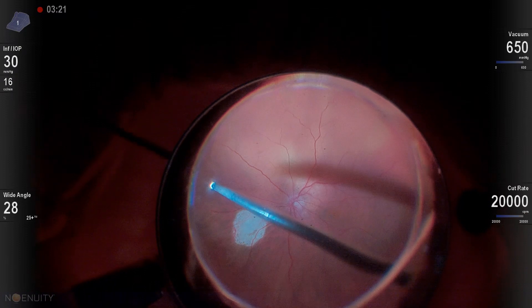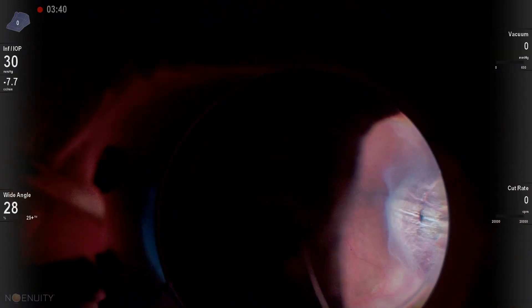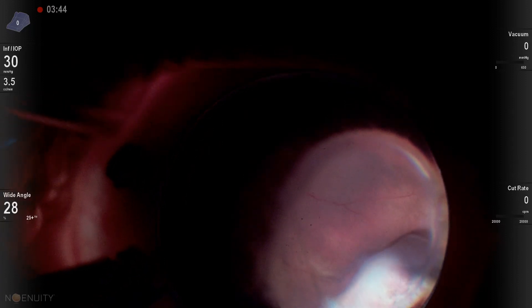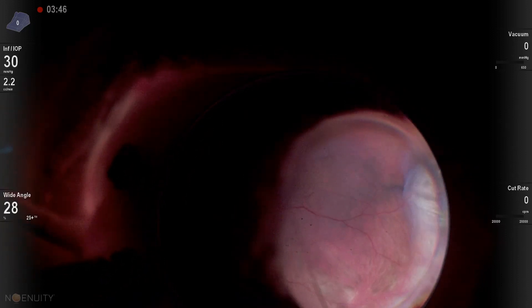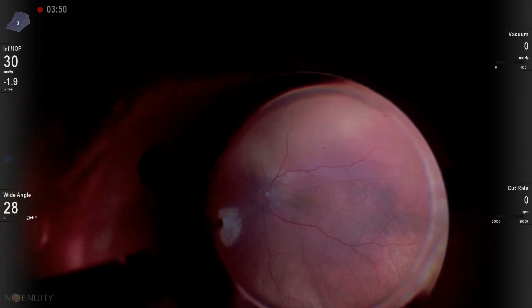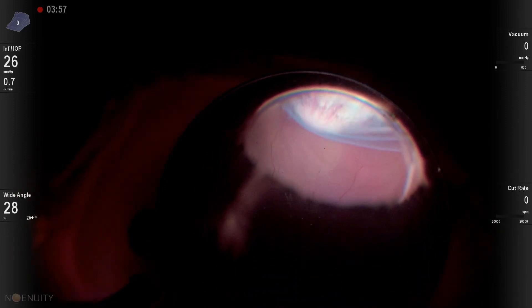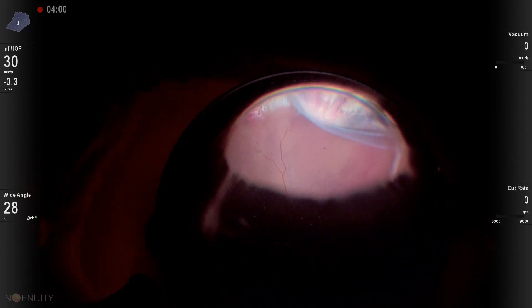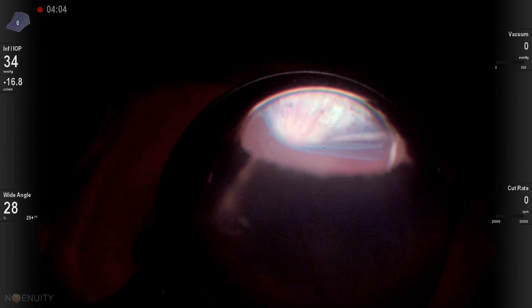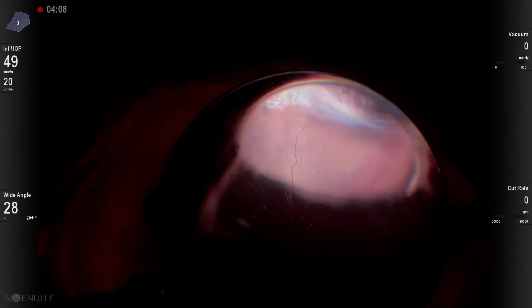I'm going to start by doing a core vitrectomy all the way around to see if there's any peripheral vitreous left, then a peripheral depressed exam. I do this pretty thoroughly — I'm going to look all the way around and see if I can find a causative break or tear. There were several suspicious areas inferiorly. The patient was still macula on. This is the area I had the biggest question about — several ratty areas in the inferior retina where you can see they had previous laser. Don't forget to depress all the areas, even the areas that are still attached.